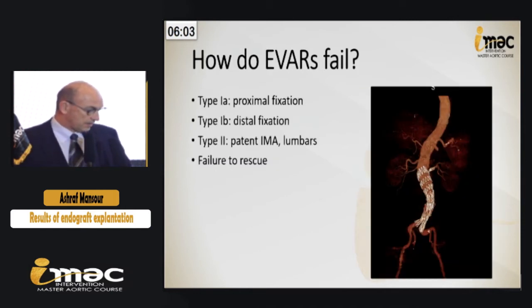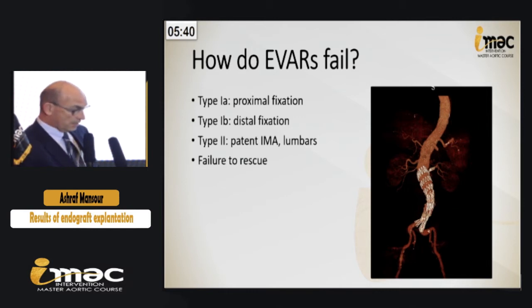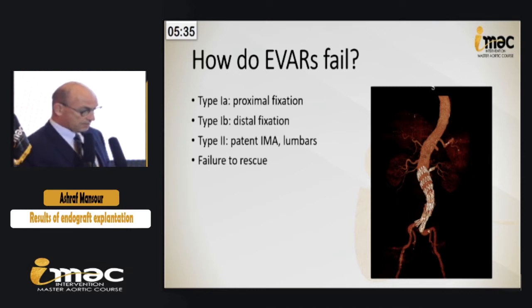The EVARs fail mostly because of proximal and distal fixation problems, which again, as in the previous discussion, you heard that if you start violating the instructions for use, you're running into issues. On this picture of a CT scan of a patient that I did about 2 or 3 months ago, this is a patient that had a physician-modified stent graft. They created a hole in the fabric of the graft, then put a stent. So basically, it's a back table modification of a graft.